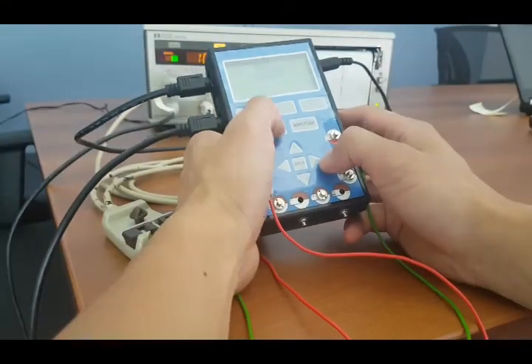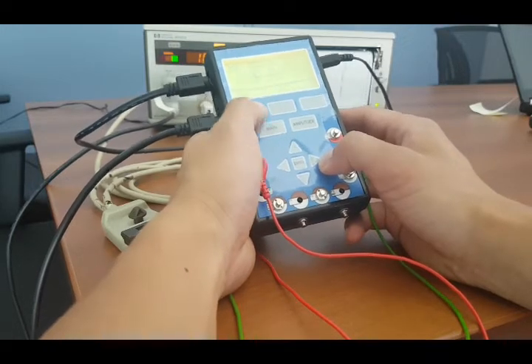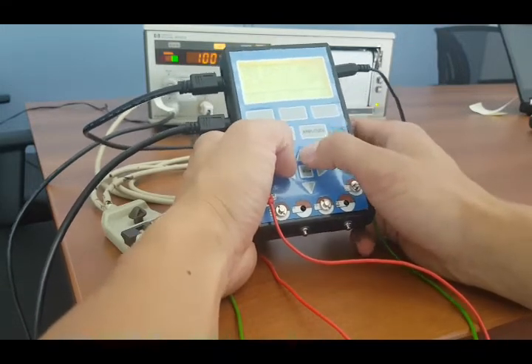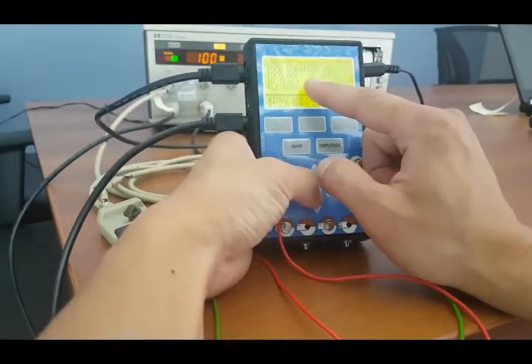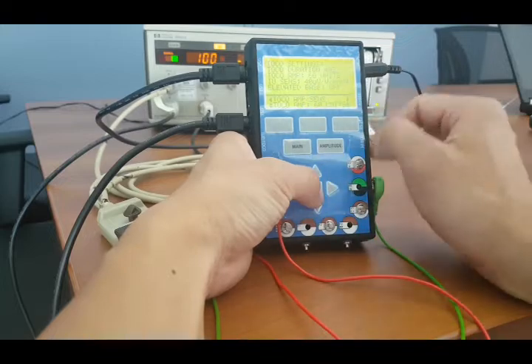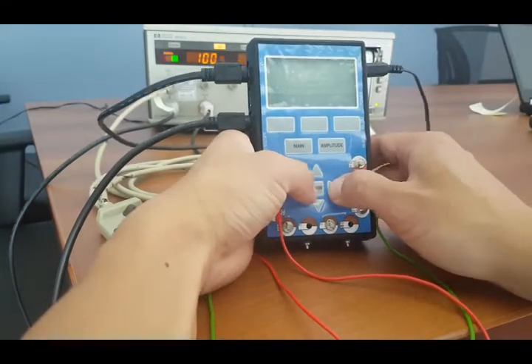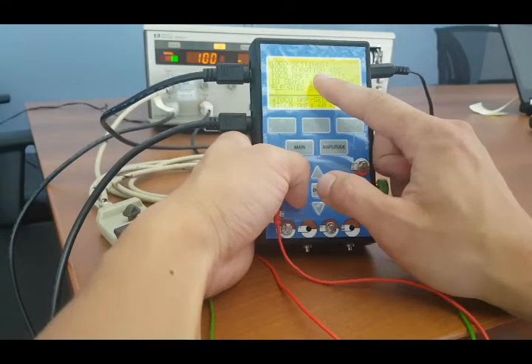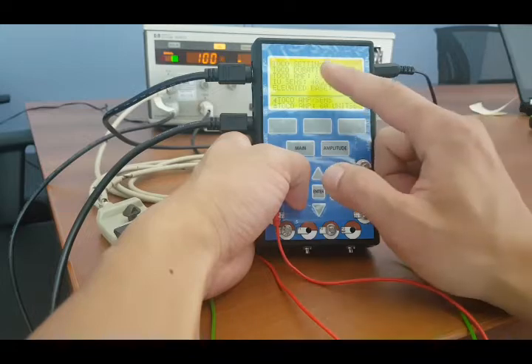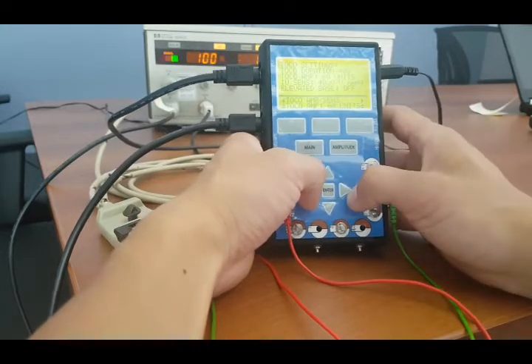For me to generate the Toco, I will go back to my main menu, go to my UA, and these values have already been pre-configured for me. You can see the IU sensitivity set for 40 microvolts per volt per millimeter mercury. I have the maximum amplitude it will reach is 60 units, and the Toco waveform is a duration of 40 seconds, the typical bell curve.